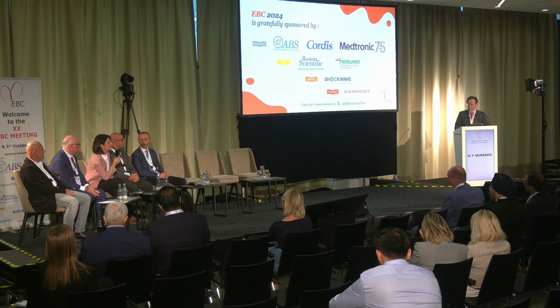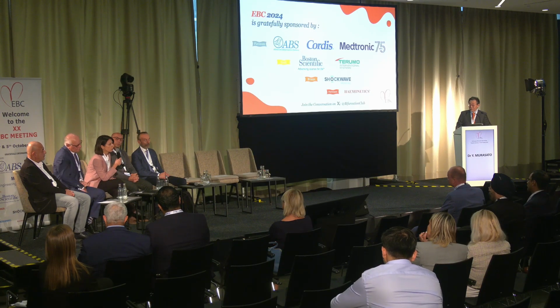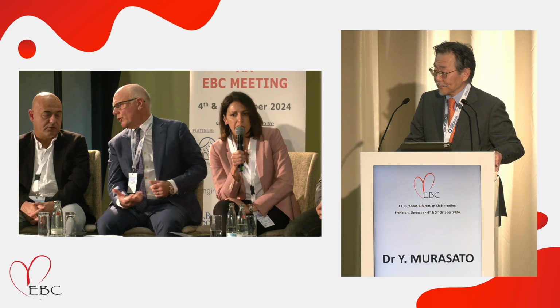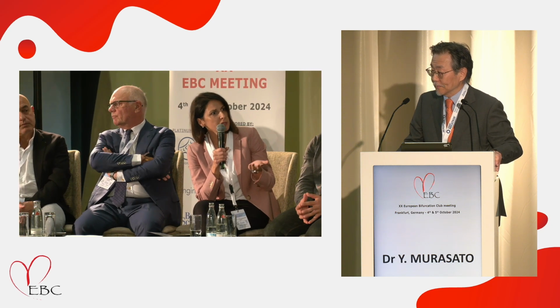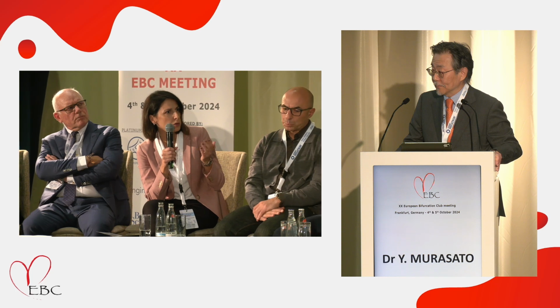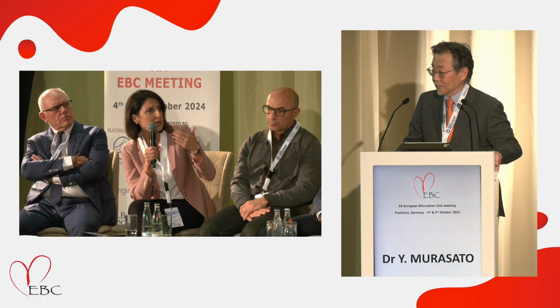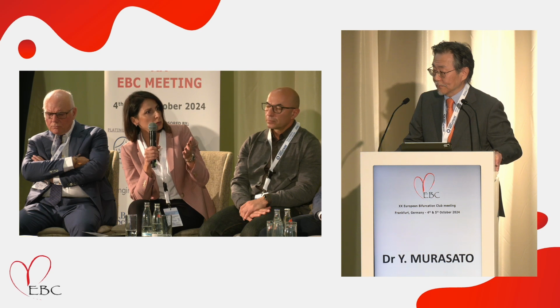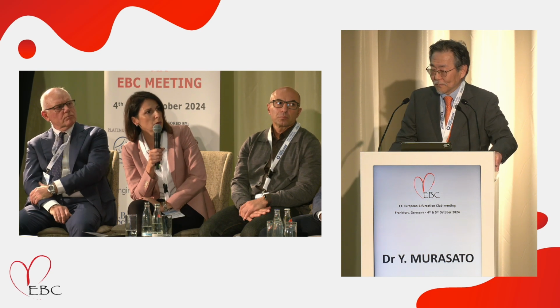Really excellent case. I congratulate you. I have one question regarding the use of the atherectomy device, because I didn't have any chance to see it. Are there different sizes of this atherectomy device or not, and are you going to prepare the lesion after this atherectomy with some NC or cutting balloon before applying the DCB?